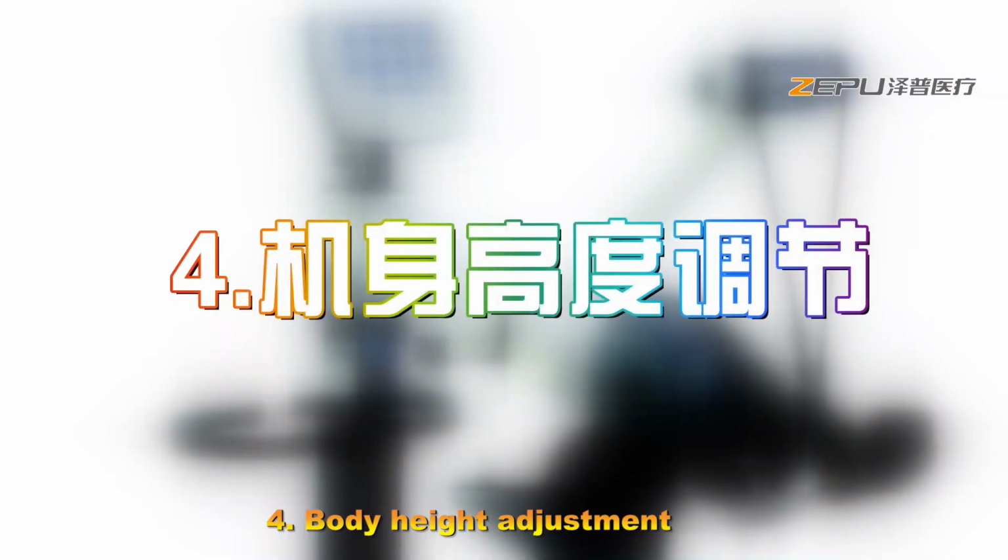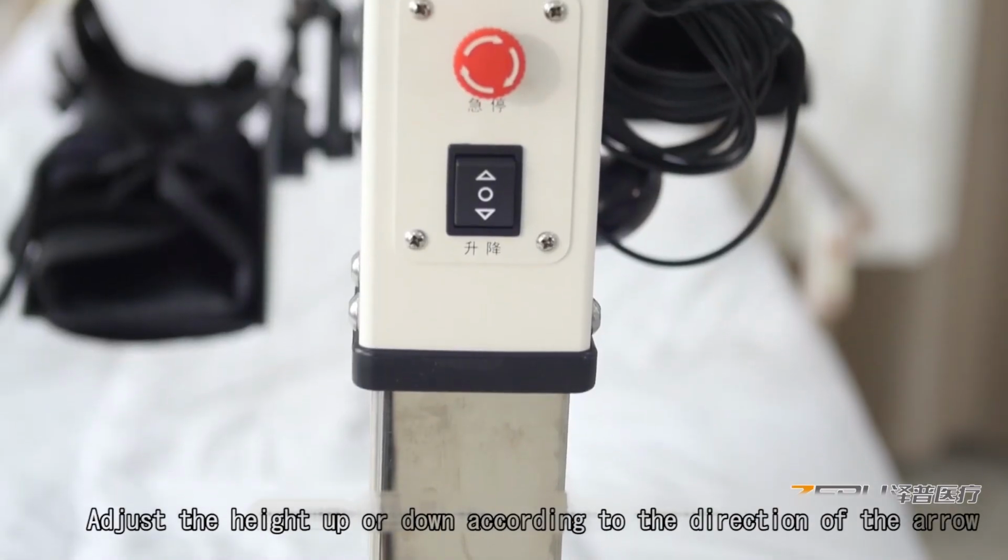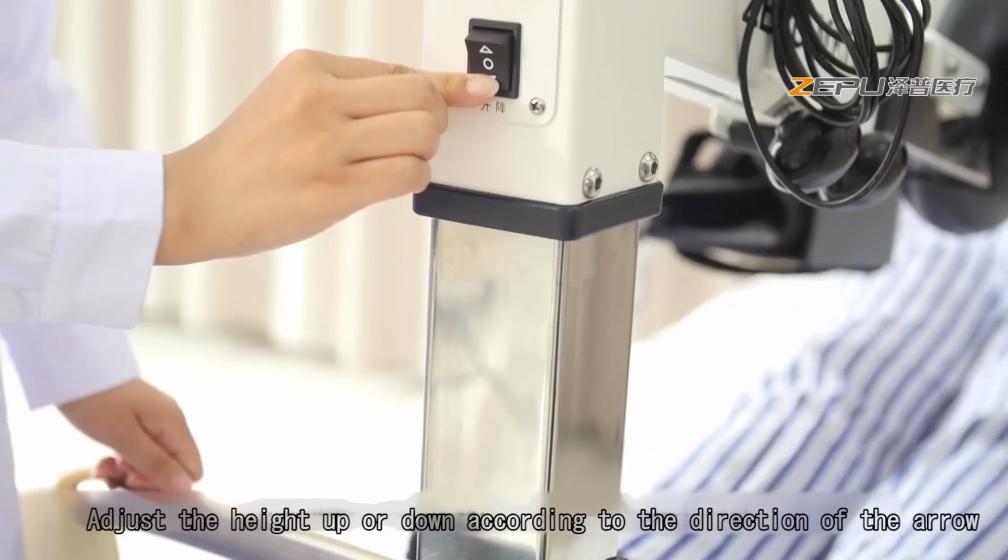Four, body height adjustment. Electric body adjustment device. Adjust the height up or down according to the direction of the arrow.